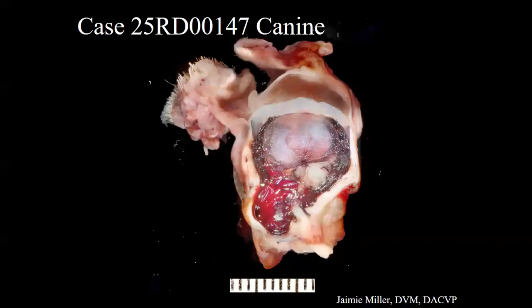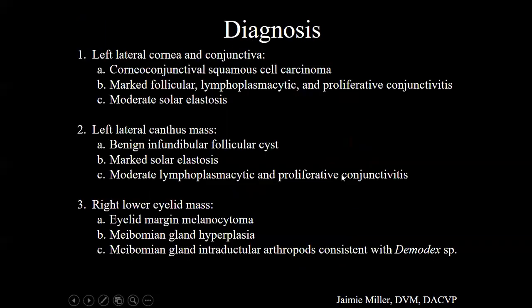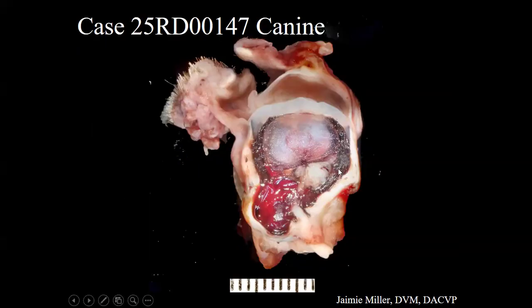Can you see it? No, oftentimes we don't catch the globe rupture sites because they can be really small. We can have the foreign material. I imagine it would have been somewhere here-ish. They can be less than a millimeter in diameter, so they can be really hard to see. So it was sort of a lucky section.